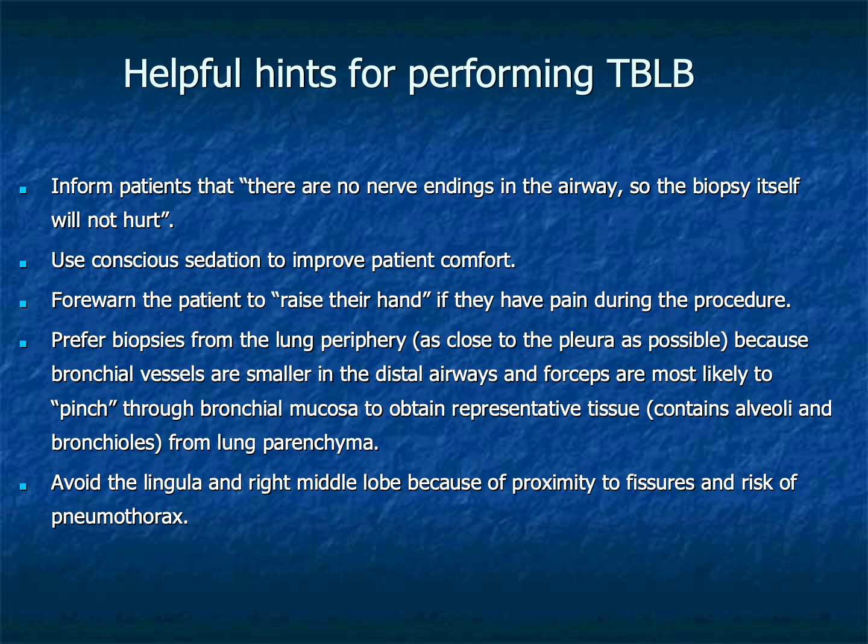Several practical observations improve both safety and diagnostic yield. Patients should understand that lung tissue itself does not contain pain fibers and that the biopsy usually does not hurt. However, they should immediately report pleuritic discomfort, since this often indicates proximity to the pleura. Biopsies are generally obtained as close to the pleural surface as safely possible because distal specimens contain representative alveolar tissue while avoiding larger proximal bronchial vessels.